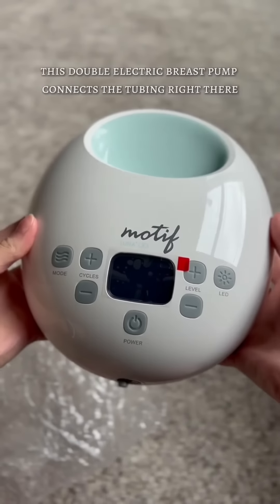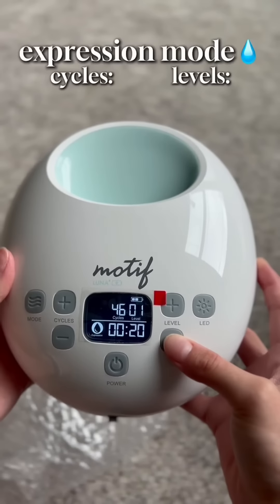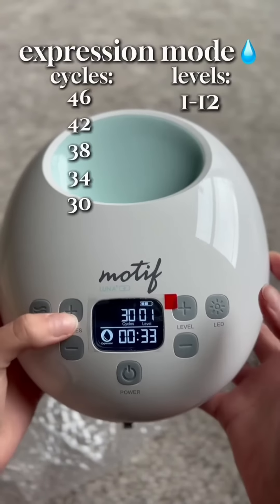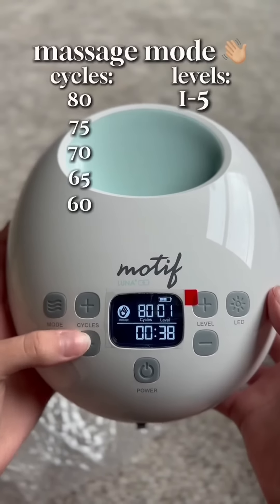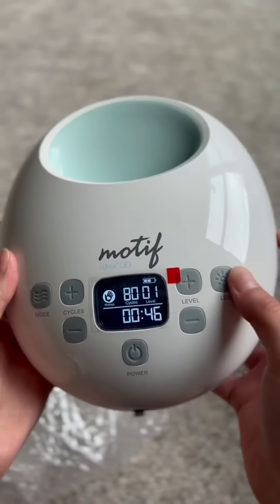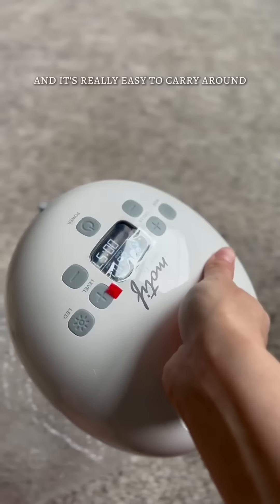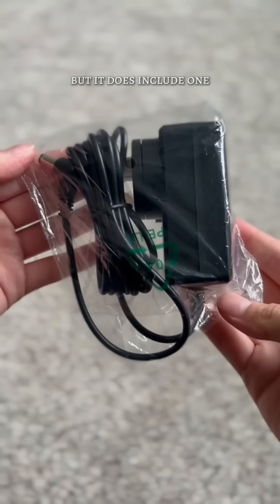This double electric breast pump connects the tubing right there. When turning on, on expression mode, there's up to 12 levels of suction and the option to customize with 5 different cycles of expression. There's 5 cycles and levels for massage mode. This LED light is great for those middle-of-the-night pumps and it's really easy to carry around. Since it's rechargeable, you won't need to charge it often, but it does include one.